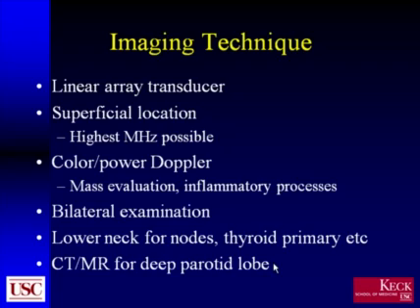Normally, although the patient will typically present with a unilateral process, a bilateral examination is a good idea because many of these things may be multifocal. Inflammatory processes may be bilateral as well.